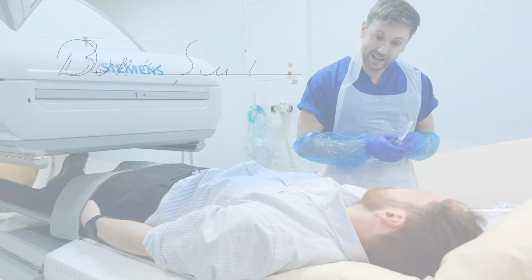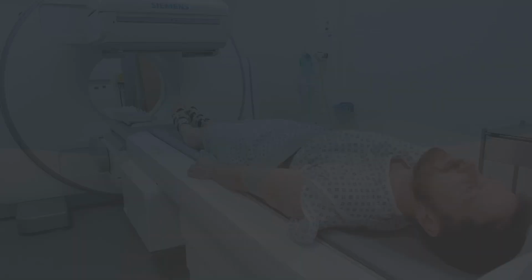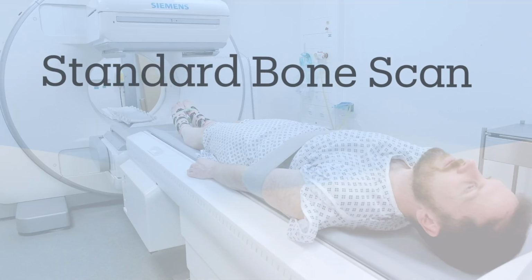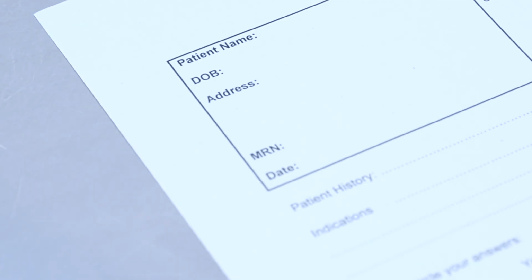Let's now discuss the protocol itself. Please remember that there may be similarities and differences in protocols from hospital to hospital. Just like any other hospital, we always perform the patient identity check to ensure you're speaking to the correct patient. Getting their history is a vital part of the process. Understanding the patient's condition may provide you with the information necessary to determine which protocol you should use.